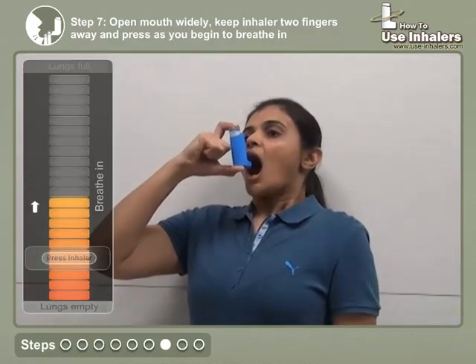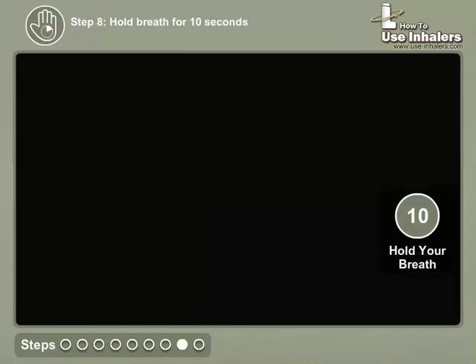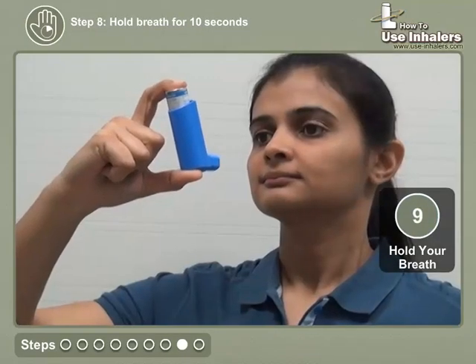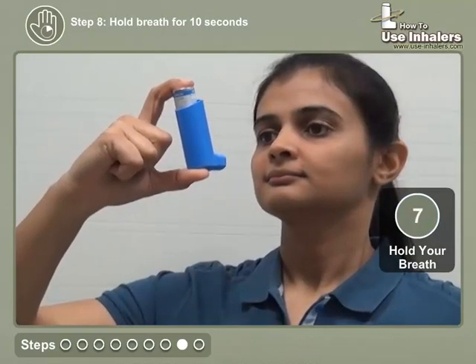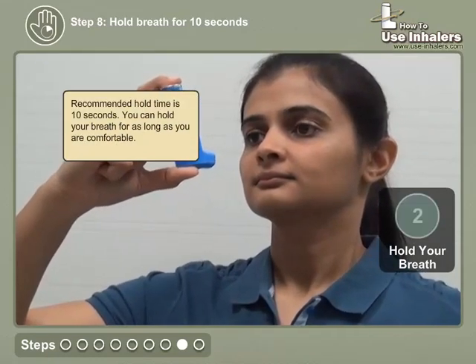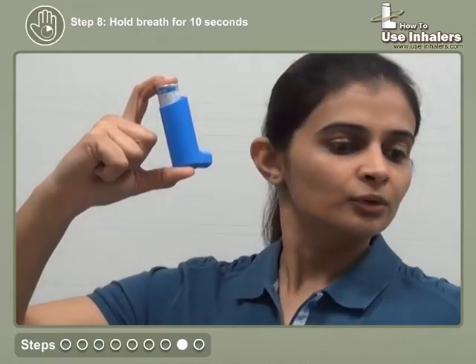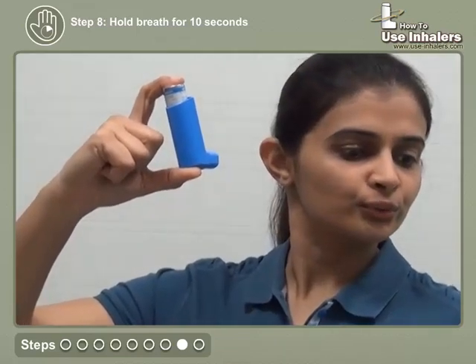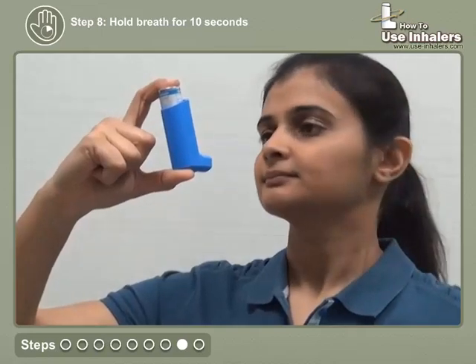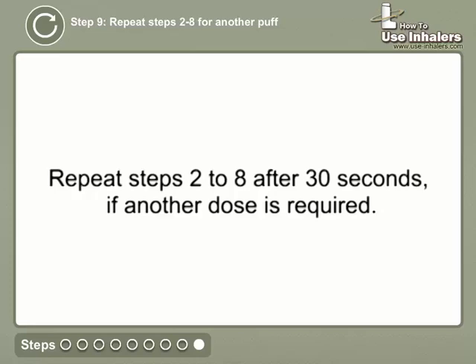Press it as you begin to breathe in slowly and deeply. Hold your breath for 10 seconds or as long as you are comfortable and breathe out slowly. Repeat steps 2 to 8, after 30 seconds, if another dose is required.